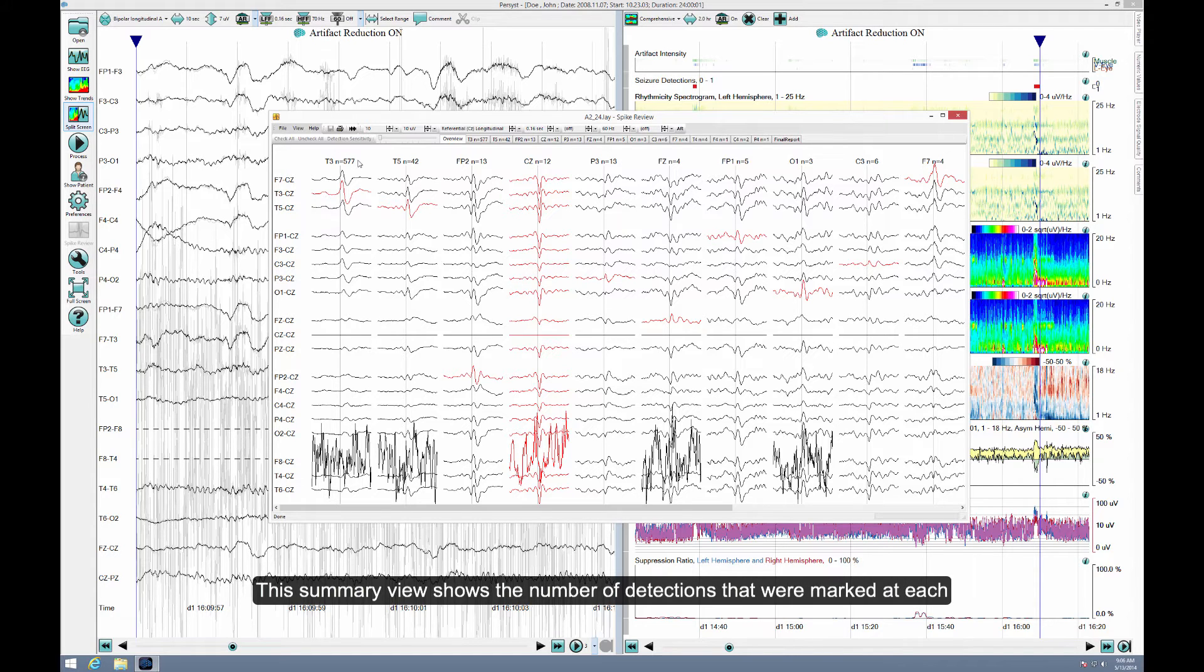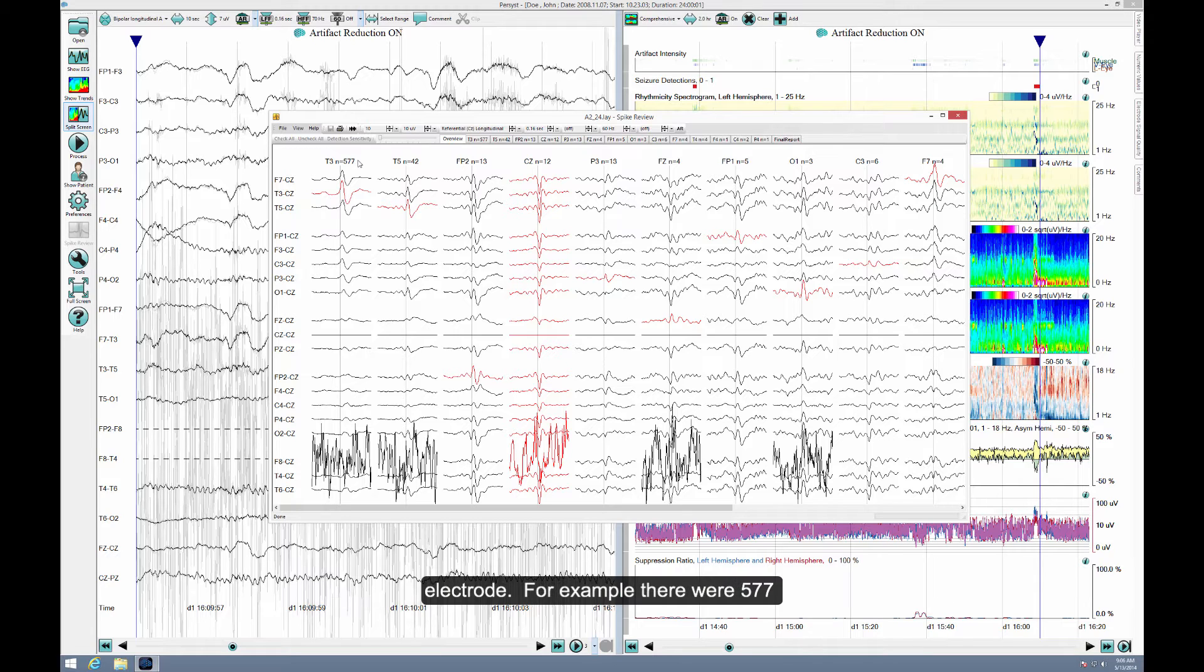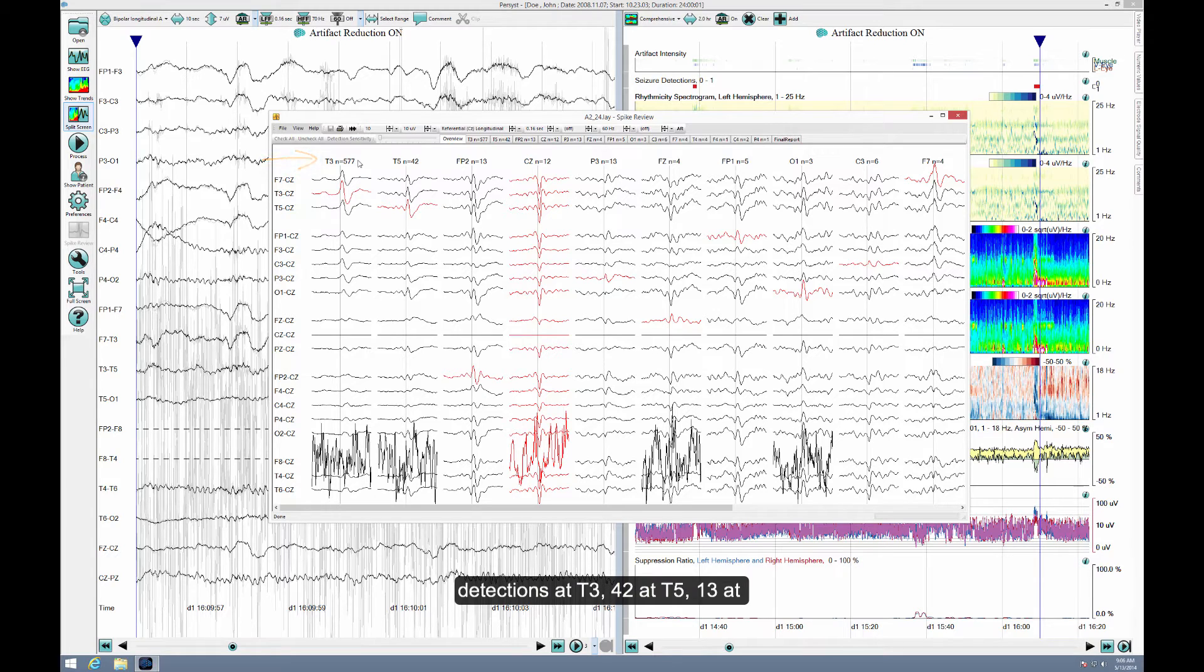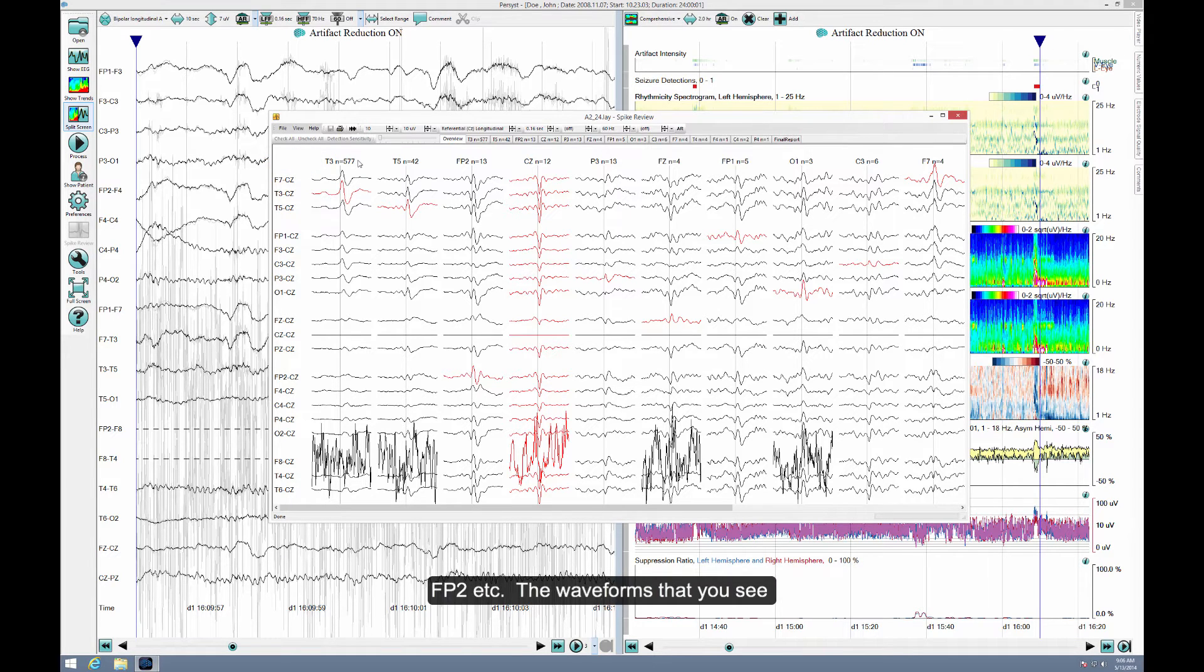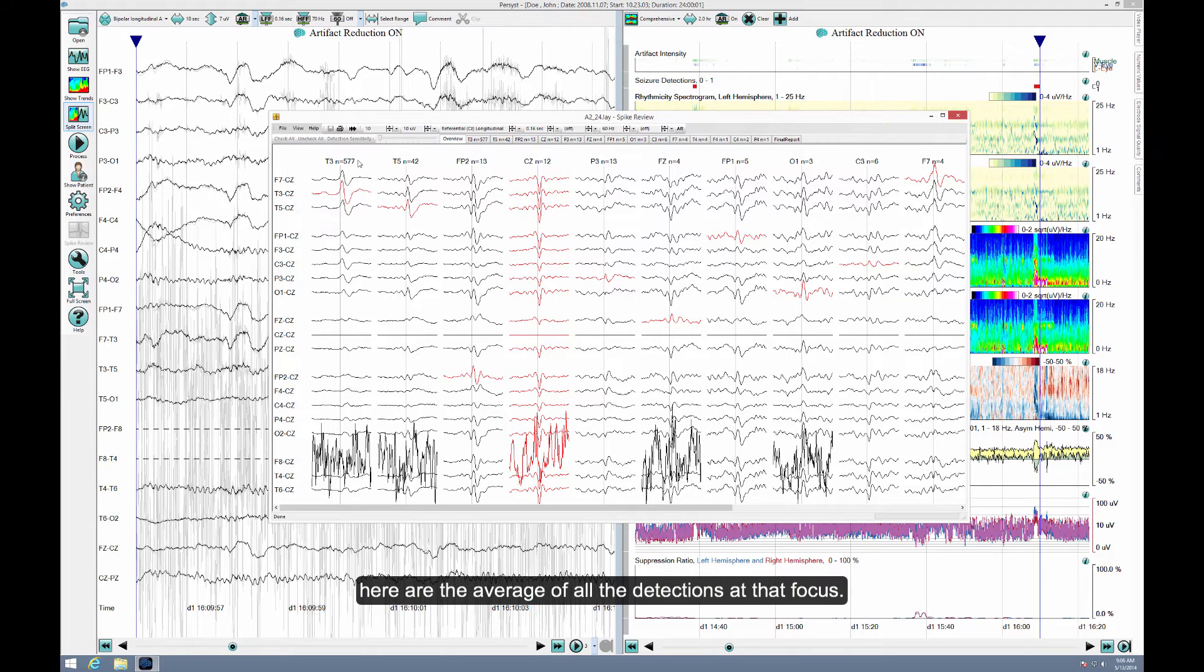This summary view shows the number of detections that were marked at each electrode. For example, there were 577 detections at T3, 42 at T5, 13 at FP2, etc. The waveforms that you see here are the average of all the detections at that focus.